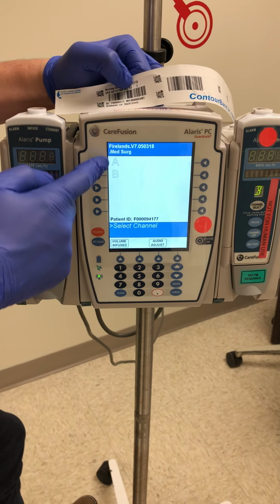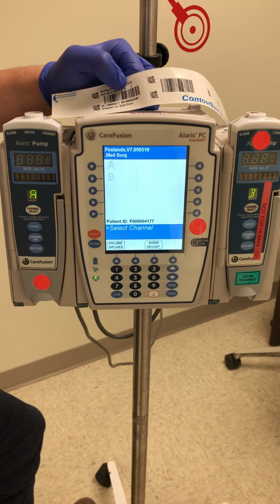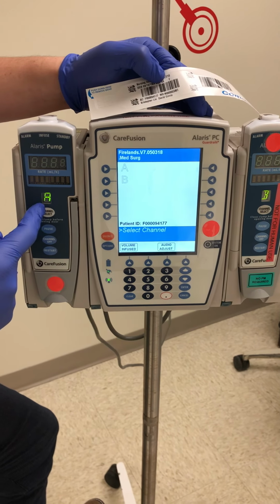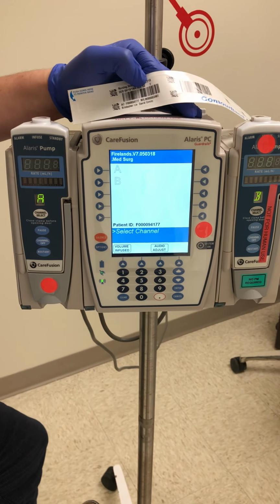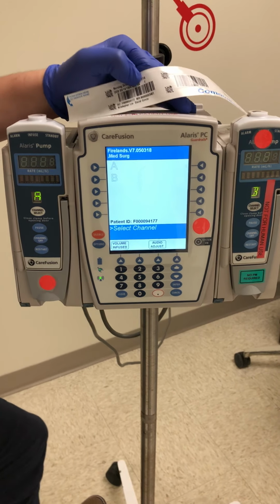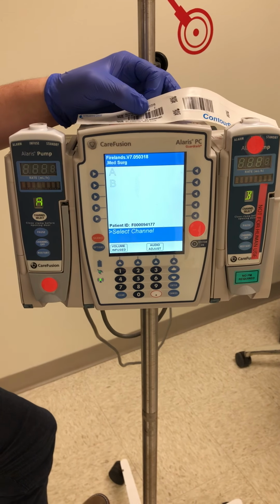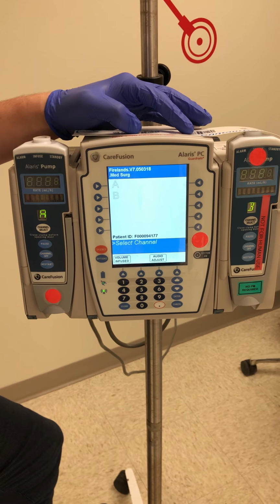So you'll notice on the main screen here you have A and you have B. What that is referring to is the 2 channels that are connected to the IV pump, and you'll see that it is labeled channel A and channel B. So when we're going to infuse our medications, we want to make sure we're selecting the correct channel that the tubing is going to be connected to. I'm not going to have any tubing or medication going right now. I'm just going to show you the process of hanging primary fluids and then secondary fluids and then powering the machine off.